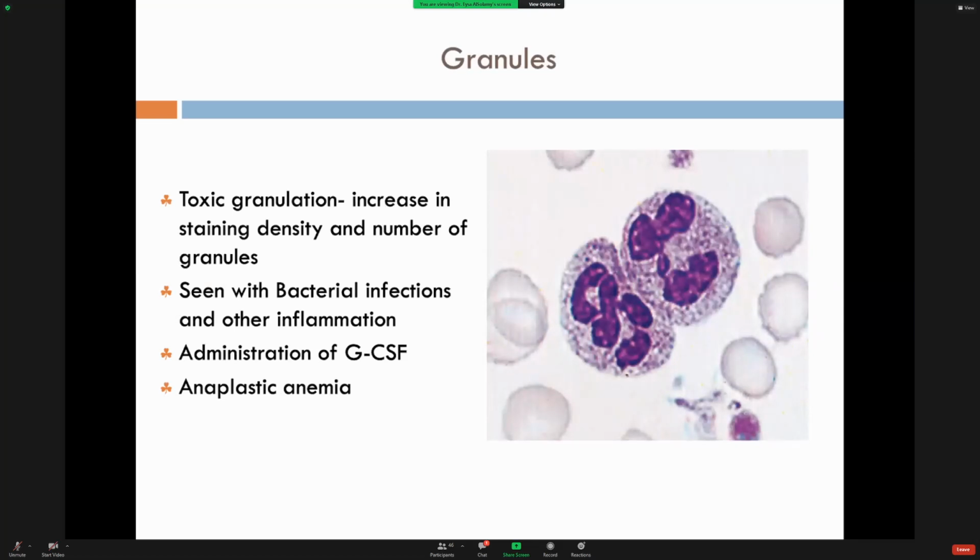Sometimes احنا we hold the chemotherapy حتى neutrophil count to be above 1. فأنت to avoid the delay of chemotherapy in some toxic chemotherapy we give G-CSF اللي هو granulocyte colony stimulating factor أو ال other name اللي قلت لكم اسمه filgrastim في أكثر من اسم له. Aplastic anemia can look like this shape.